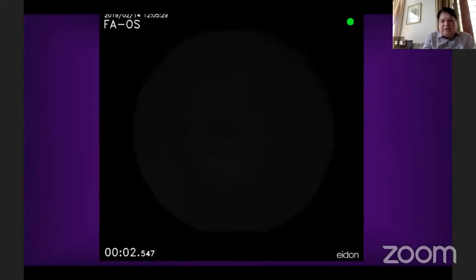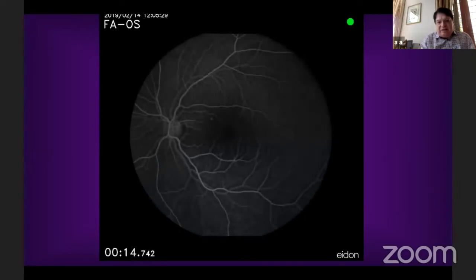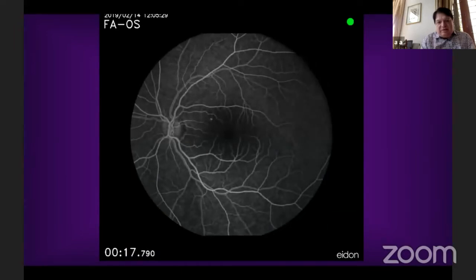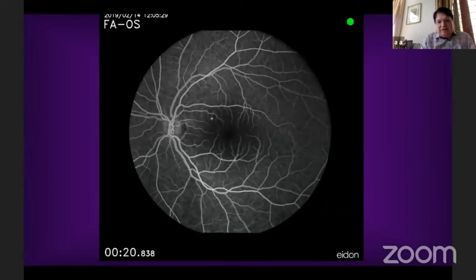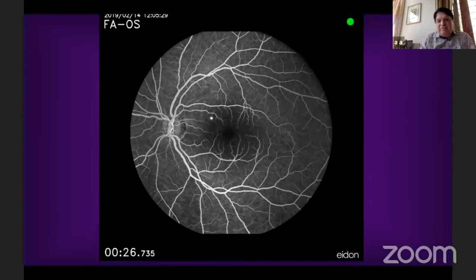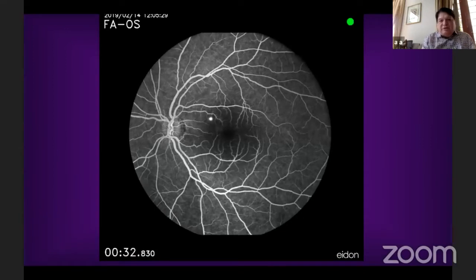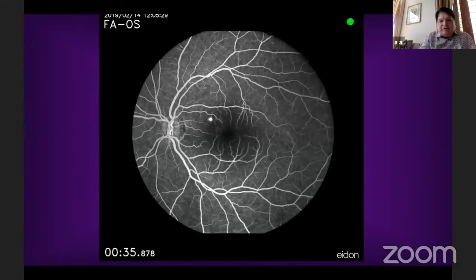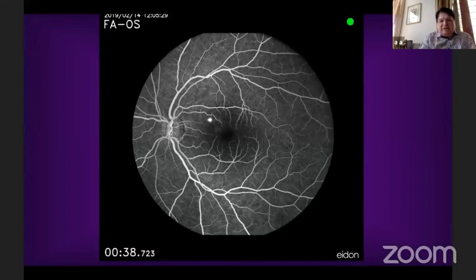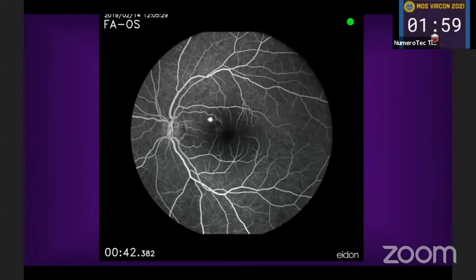Now suppose you go to the video angiography. See, video angiography has started, you have injected, and the pictures start coming. Now you've seen the arterial phase. Now you can start seeing a hyper spot there, and gradually the spot is increasing. I always feel that this is what every surgeon should see before deciding the treatment. But most of the time we see still images, images taken by your junior or somebody. Here the 7 seconds and everything is over. Now you're seeing the choroidal phase going. So you know how much the leakage is.